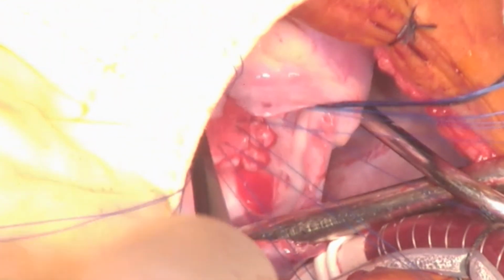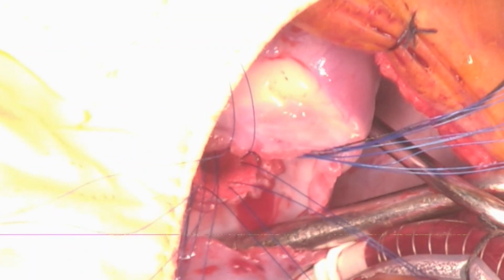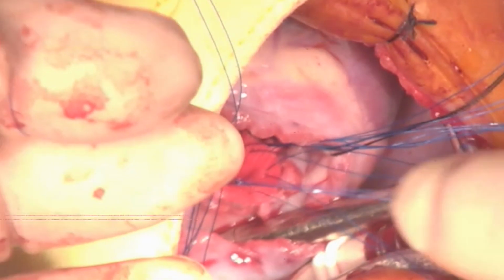The patch is then parachuted down into place and the sutures are tied.